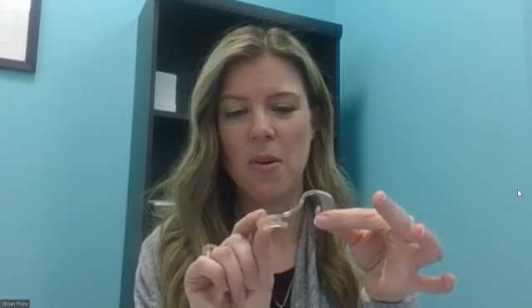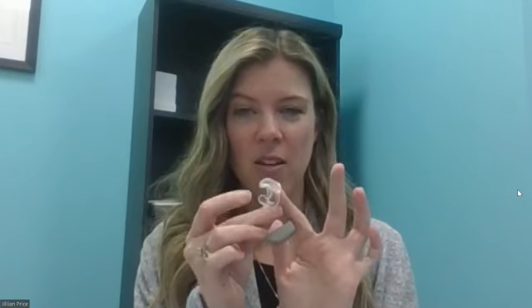Linda says, how do I remove the molded earpiece for cleaning? And how do I replace the inner wax filter? Okay, so I can definitely show you this part. So she's asking, how do I remove this from this? That's a great question, because you do have to remove it if you want to clean this. Remember, I had mentioned that this can be cleaned with soap and warm water because there's no electronics in it. So this is how you do it.